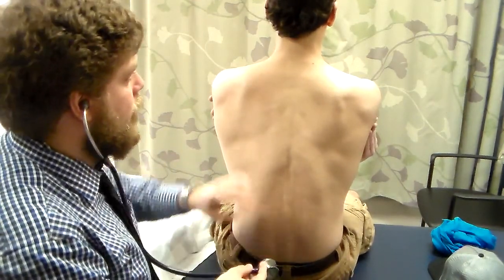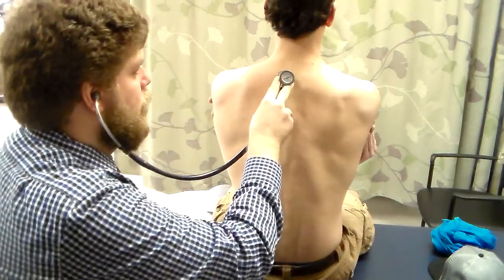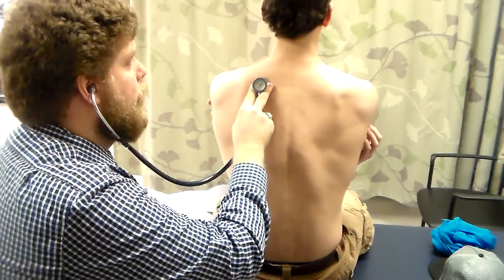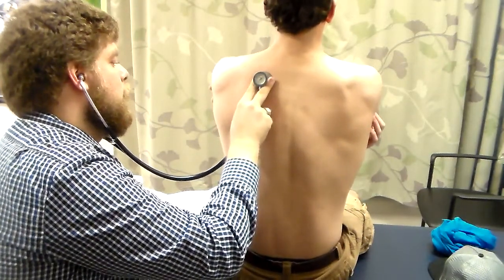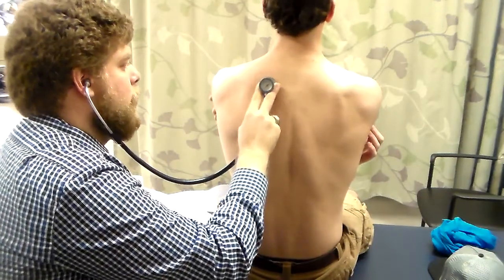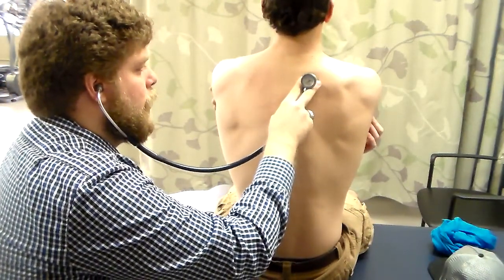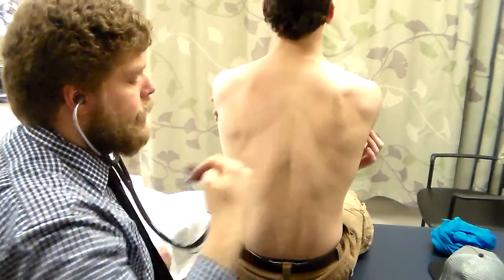Let's go in. And we're just coming laterally, slightly. Breathe in for me. And breathe out. Breathe in. And breathe out.